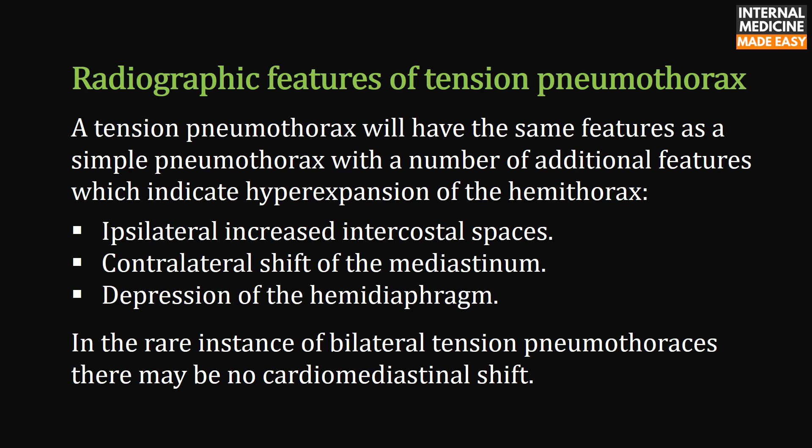Additional radiographic features of tension pneumothorax include: ipsilateral increased intercostal spaces, contralateral shift of the mediastinum, and depression of the hemidiaphragm. In the rare instance of bilateral tension pneumothorax, there may be no cardiomediastinal shift.